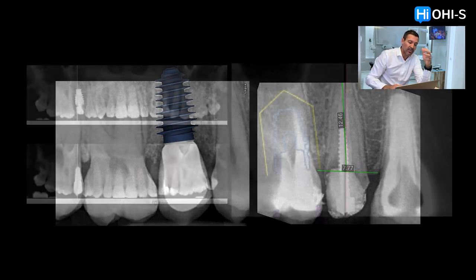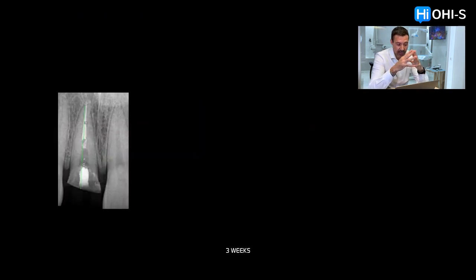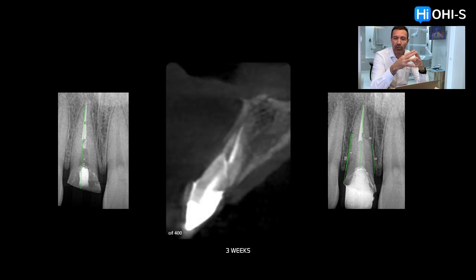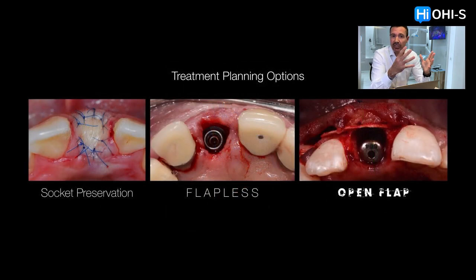In part one, we're going to see the types of complications: whether we have technical, mechanical or biological complications that we're going to need to face, and the risk factors associated with them. The complications in time: it's different to find a complication that is diagnosed early than a delayed complication that actually ended up destroying much more bone and soft tissue due to the lack of control from our standpoint.